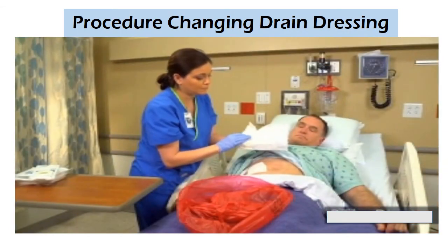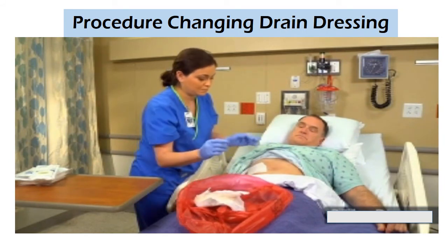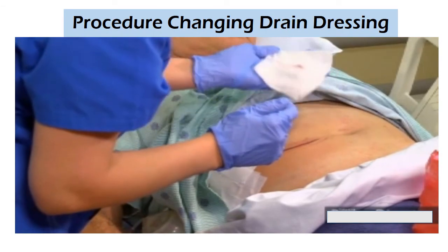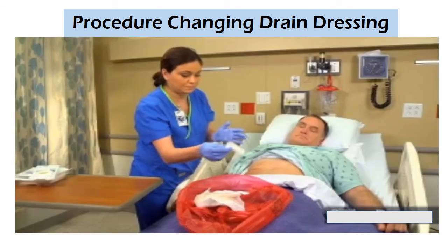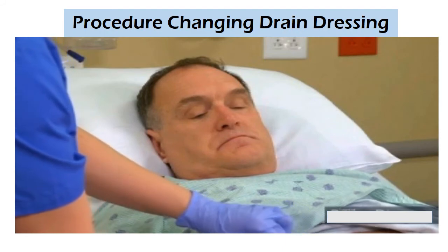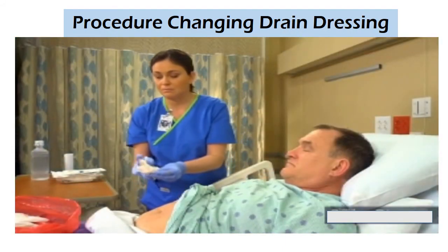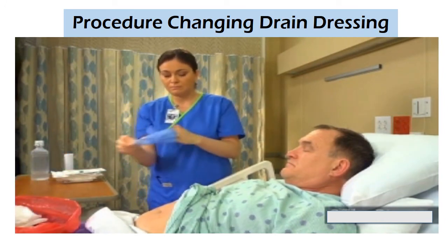Carefully discard the outer secondary dressing first, followed by the inner primary dressing, the layer that's in contact with the wound. If any drainage devices have been placed, avoid putting tension on them by slowly lifting away the layers of the dressing. Keep the soiled undersurface of the dressings concealed from the patient's view as you work. Fold the dressing to contain the drainage. Peel off your gloves inside out and perform hand hygiene.